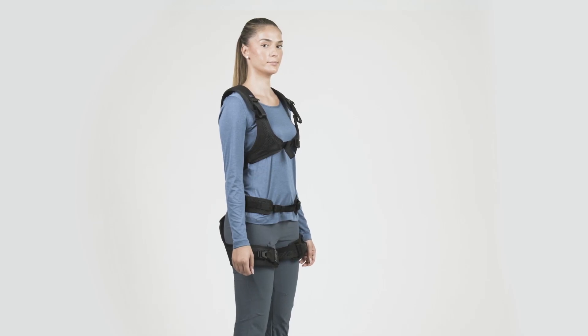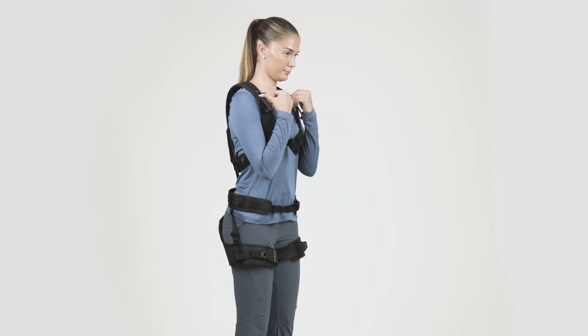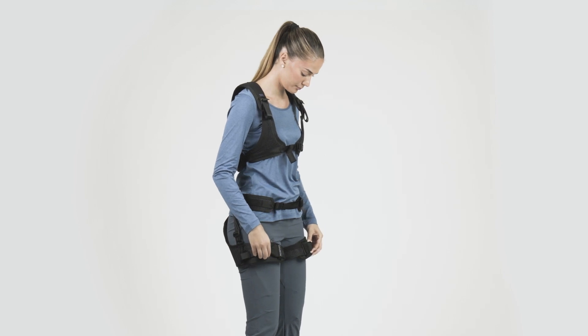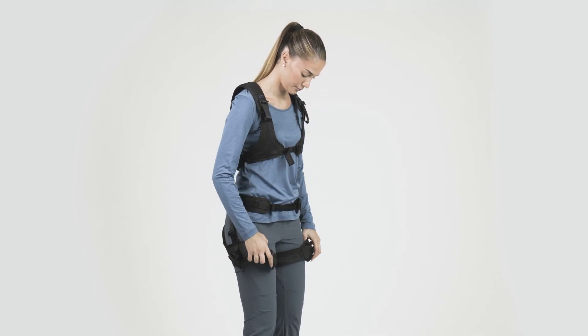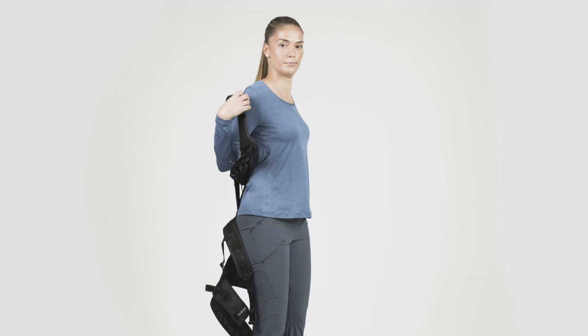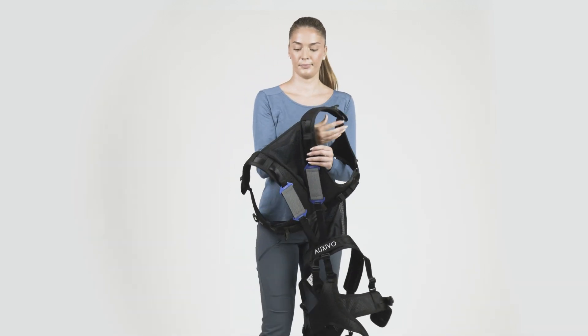When you have finished your work, the LiftSuit can be removed easily. Remember to deactivate the back support using the buckles at your collarbone and raising your knees. Then, open the thigh cuff buckles, the hip belt buckle, and the chest buckle. When the cuffs, belt, and vest are open, you can remove the Exoskeleton.